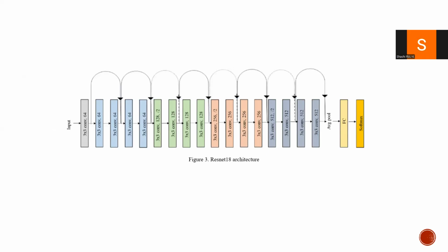Next, here we can see the ResNet18 architecture. Focal loss was used to rectify the underlying class disparity in this implementation between the tumor and no tumor categories. In a situation with class imbalance, the traditional cross entropy loss function tends to be skewed in favor of the majority class, creating what is known as the class imbalance problem. This problem is addressed by focal loss, which selectively downweights the loss attributed to correctly categorized samples and emphasizes difficult to classify cases. When implementing this ResNet18 for a classification task involving imbalanced classes, focal loss is integrated as the custom loss function during training. This strategic integration ensures that the model prioritizes learning from the minority classes, thereby improving its discrimination and classification of rare or challenging examples.